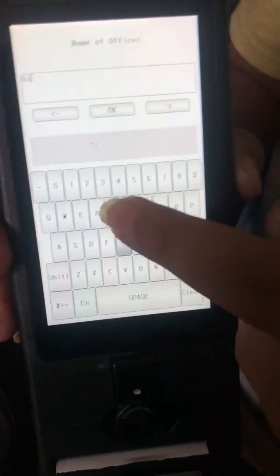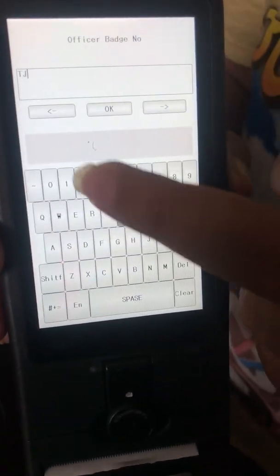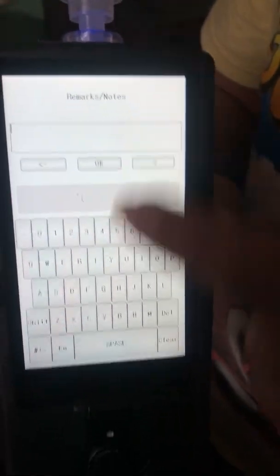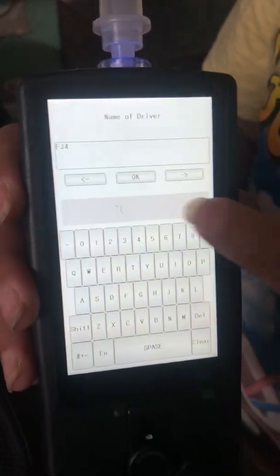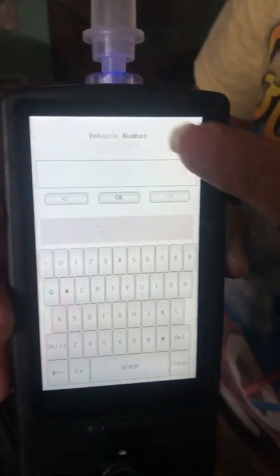First, it will ask the name of the officer — you can type anything here. The second option will be the officer badge ID or badge number — you can put any number and alphabets. And if there are any remarks or notes, that is the third option. The fourth option is the name of the driver. Then it's the license number, and then the vehicle number.